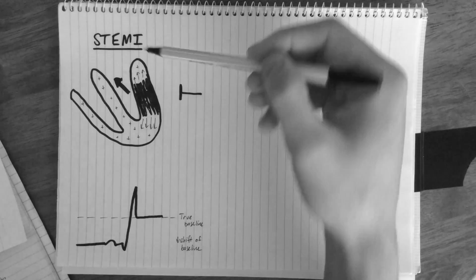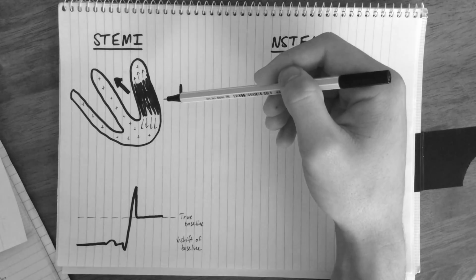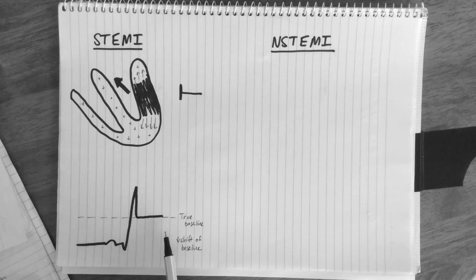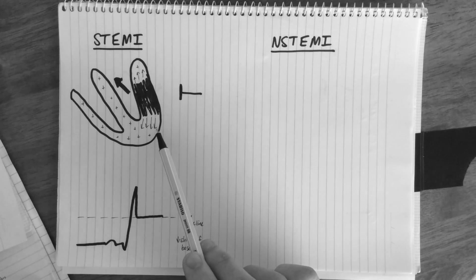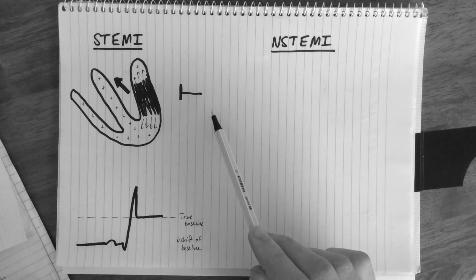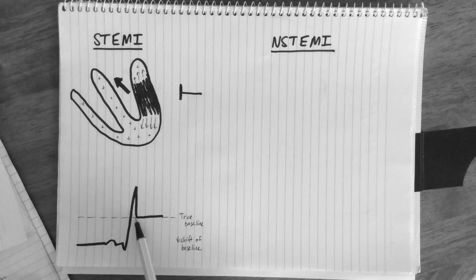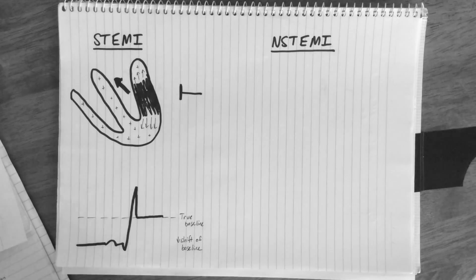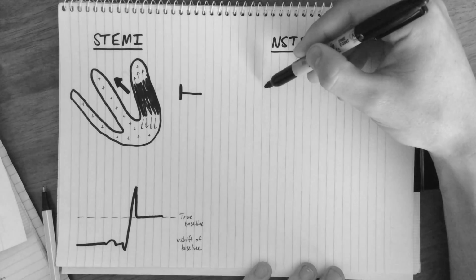Infarctions are of tissue distal to whatever coronary artery has been occluded. So by determining which leads show ST elevation, we are able to localize the aspect of the heart in which the infarct has occurred and then link that to the coronary artery supplying the area. So by looking at our 12-lead ECG, seeing which leads are showing ST elevation, we are able to deduce which coronary artery is affected and then tell the cath lab to thrombolyze accordingly. It's a similar story for NSTEMIs.